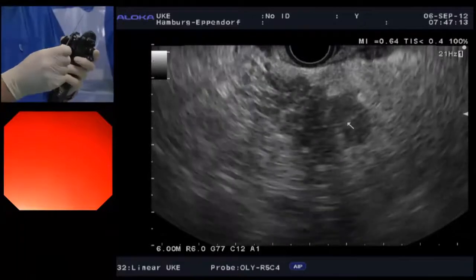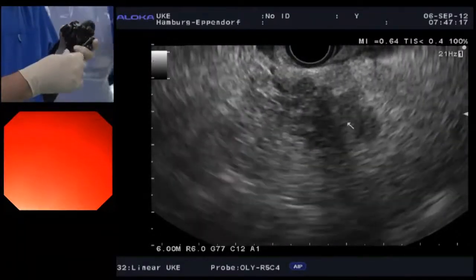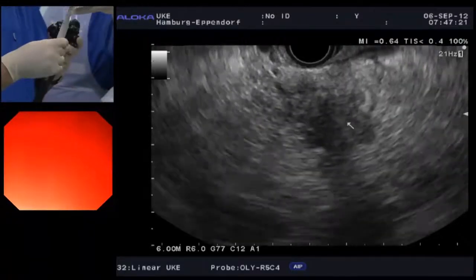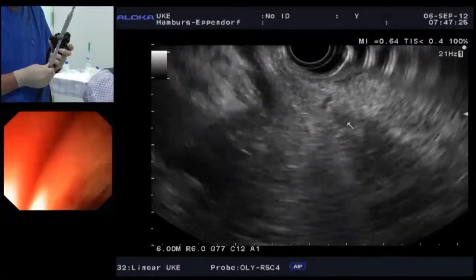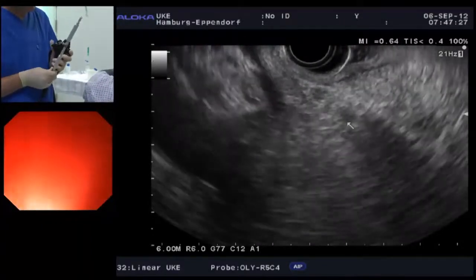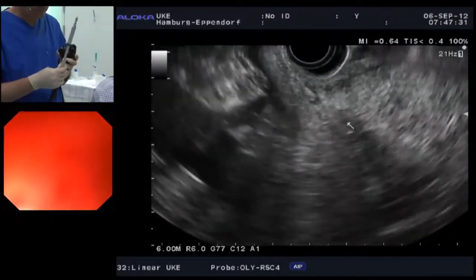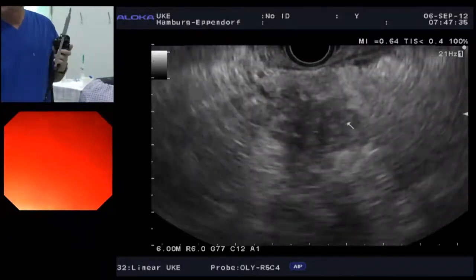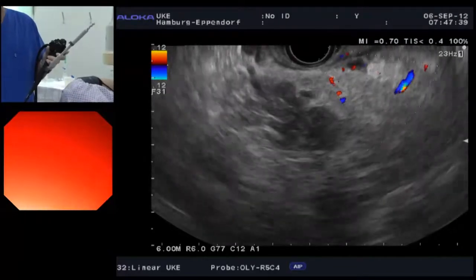Bob, I just wanted to add to the point, particularly for the new endosonographers, it's very helpful, if you can, to have a cytologist present in your laboratory to give you that immediate feedback if you're getting a good cytologic sample. It's critical that we get a diagnosis in EUS. That's one of our main roles. And to have the cytologist present to say that you have a good sample has been shown many times now that it improves your diagnostic accuracy.